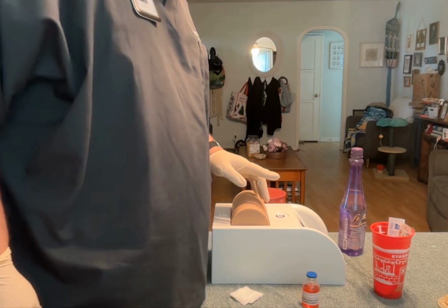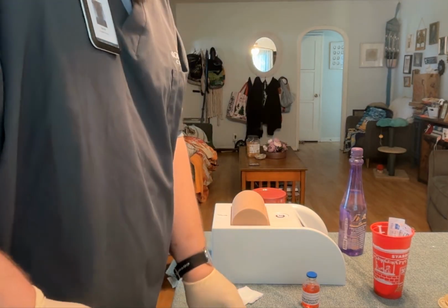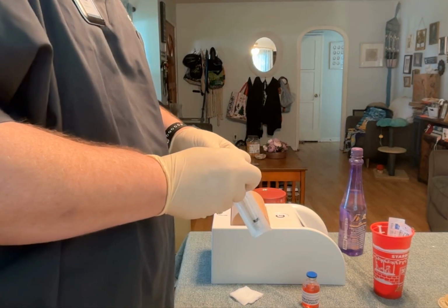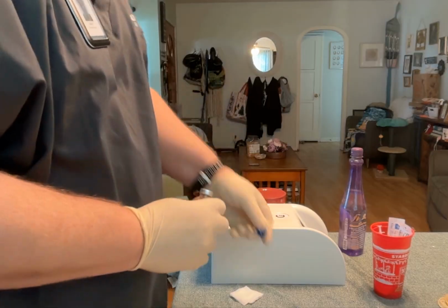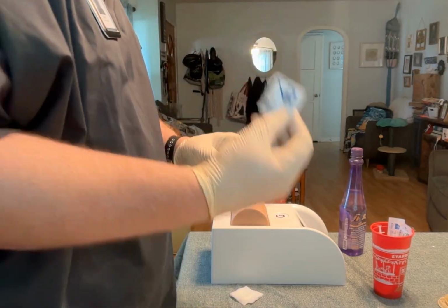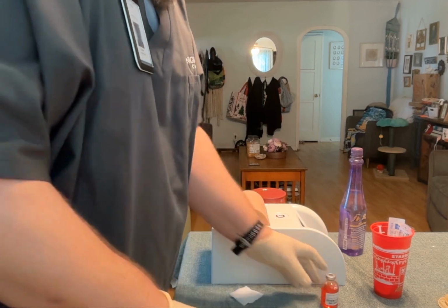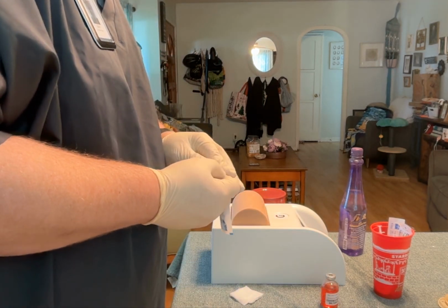So I'm going to get my medication prepared. I'm going to open my needle. First, I'm going to take my morphine, and I'm going to clean the site with an alcohol pad, the rubber stop. While that dries, I'll get my syringe ready.